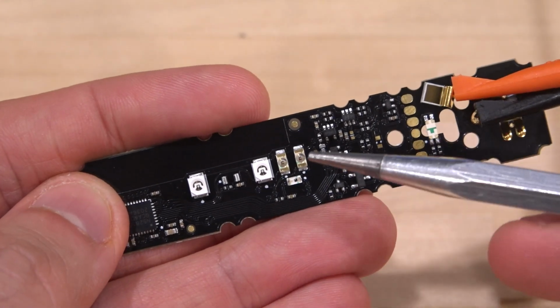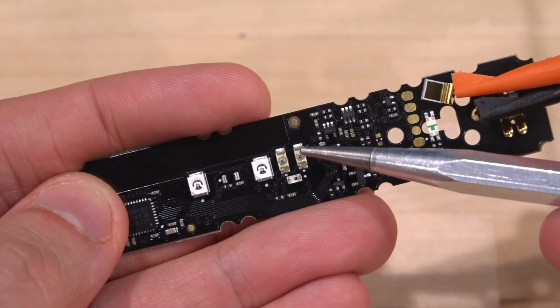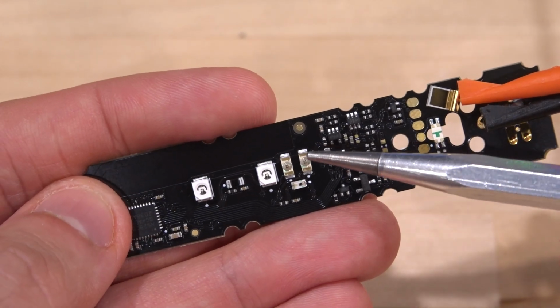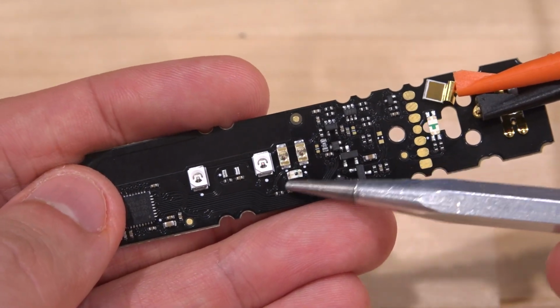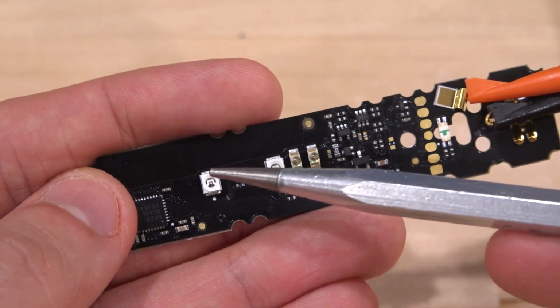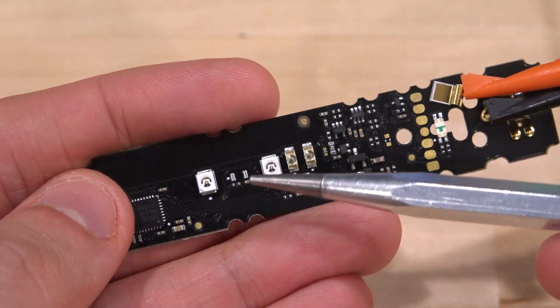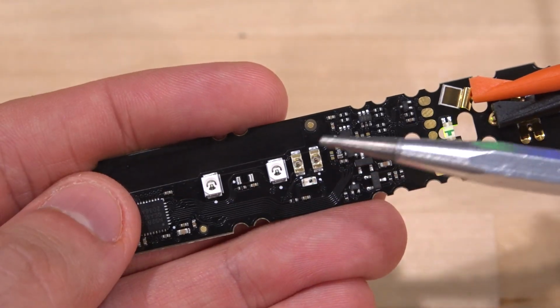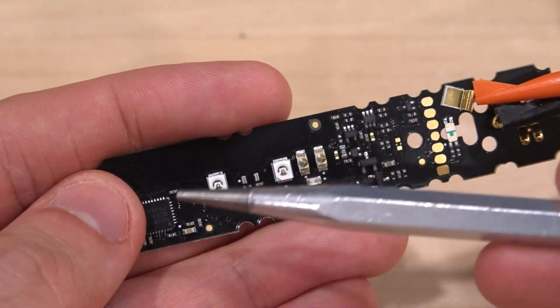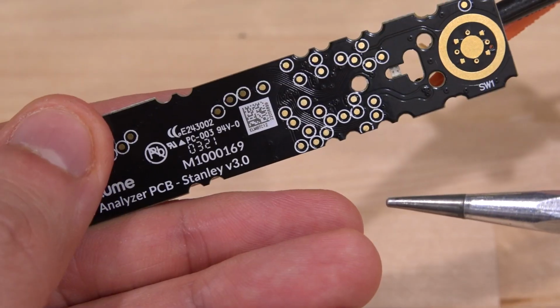That's interesting. So if the red is for detection, detecting blue strips after the test is done makes sense, because you can affect the reflection of the white surface if there's a blue line on it using a red LED. These are at opposite ends of the optical spectrum, visibly at least, and then you can read it with this. There's an isolation between these, so they don't kind of interfere with each other. These blue ones could be to measure the progression of the ink as it goes through the dye, and that dye is probably blue as it moves around, or it could even be red as it moves around. On the other test, they start as blue and they turn into red, and maybe this one is opposite. And then you can see again using these two and this detector. That's just my guess, and I think this is not flashing because it's waiting for a connection to a phone.